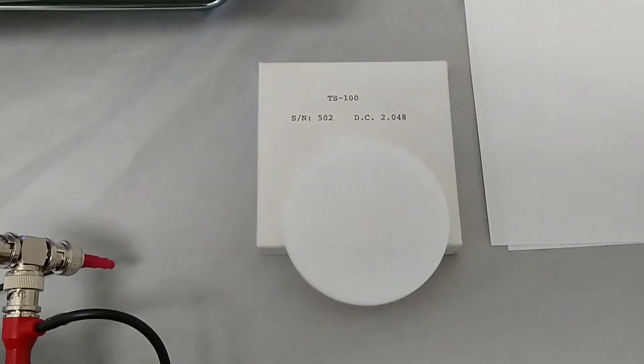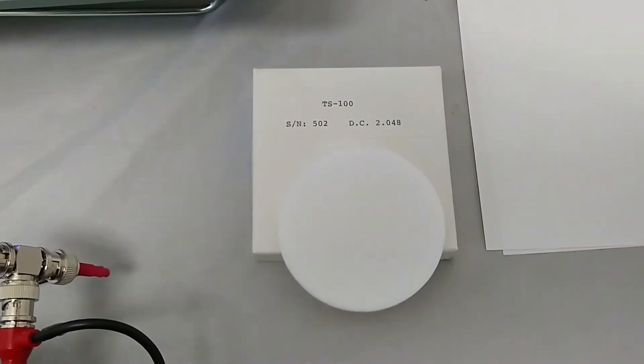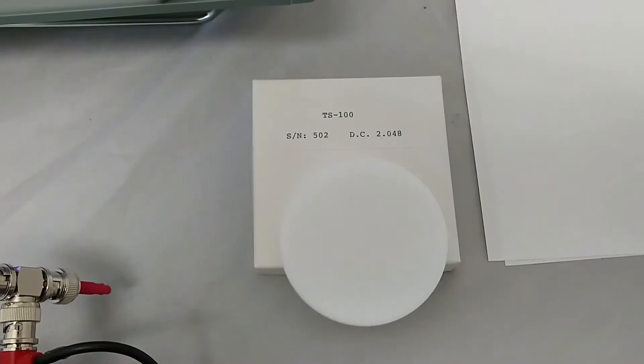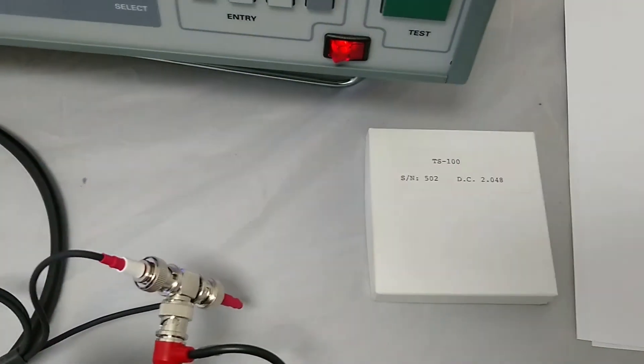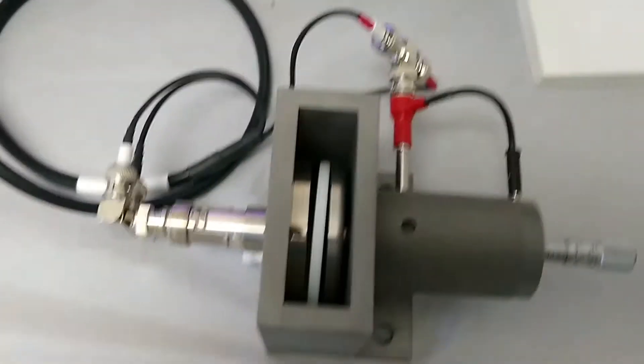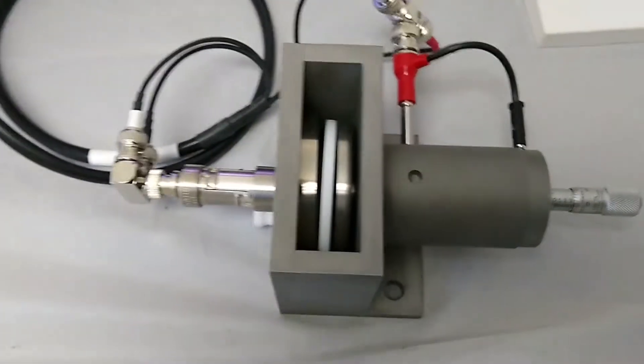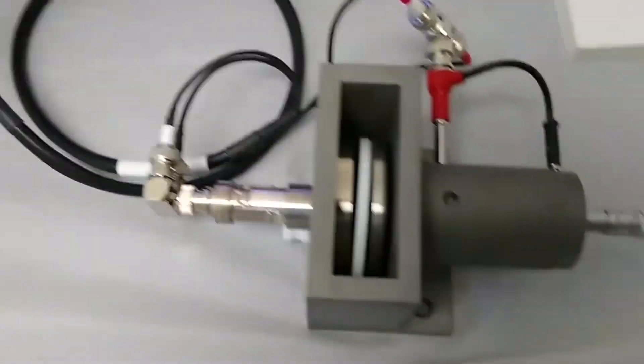We happen to have also the optional TS100, which is a Teflon standard, has a known dielectric constant, in this case 2.048. We can then take the Teflon standard, place it in the sample holder, so it's now in the sample holder.